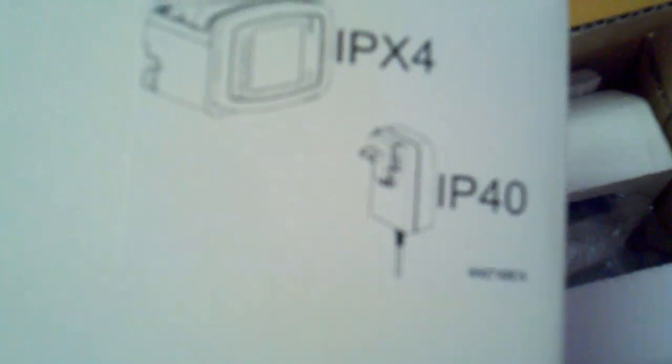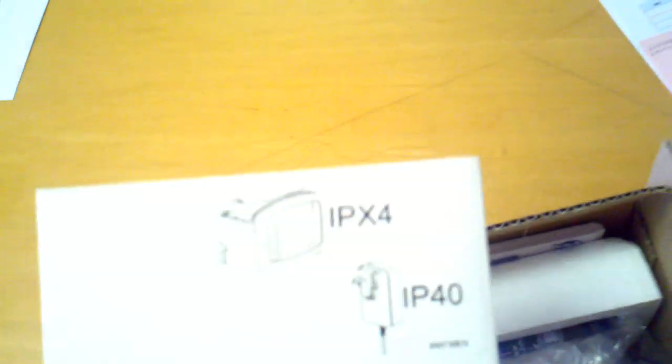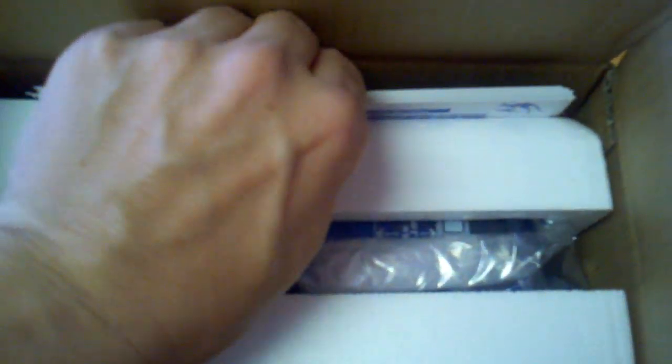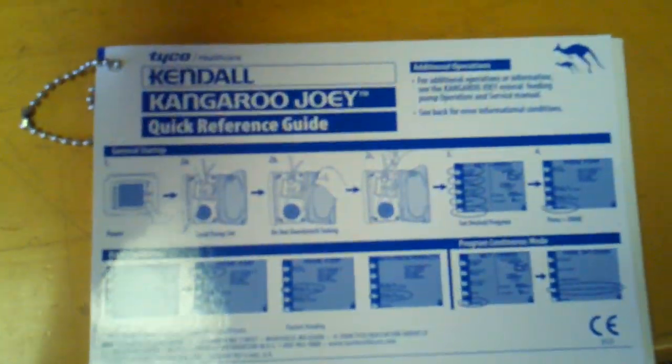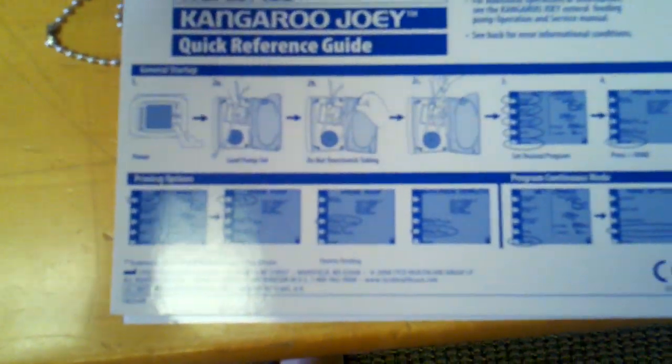It comes with a really nice CD-ROM service manual. And then looking right here, it is the quick reference guide, which is very handy.